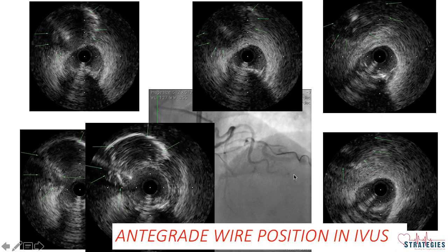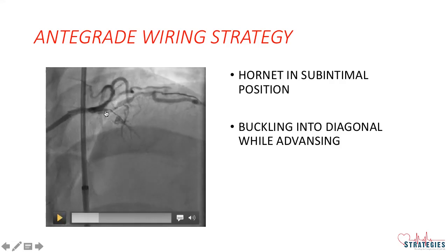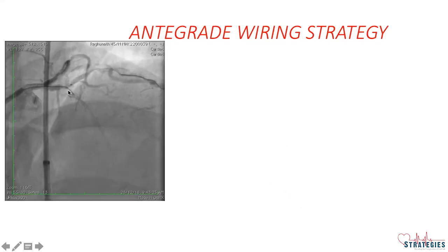I decided to shift to another drilling wire with good torque control to redirect the wire. I took off the Hornet wire and took a Gaia wire. The problem with the Hornet wire in this case was that while drilling, it was buckling into the diagonal, so this buckling prevented torque to redirect the wire. That is why I shifted to the Gaia wire — it is a drilling wire with good tip control.